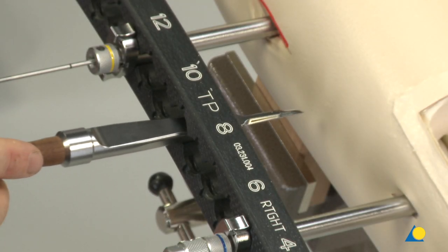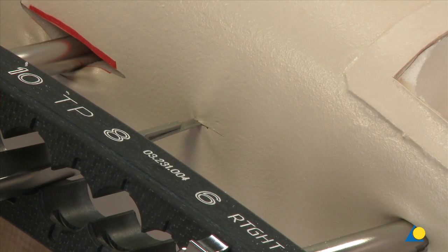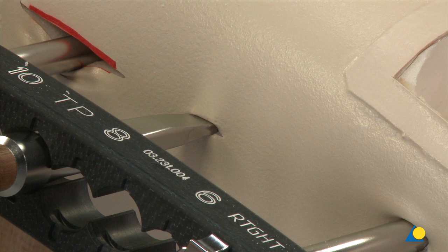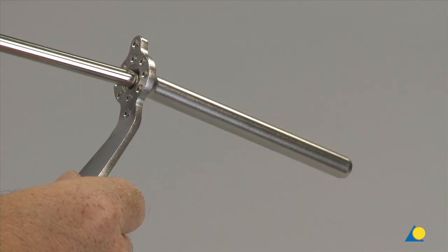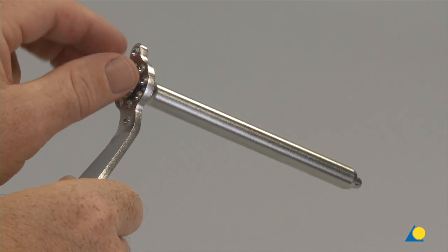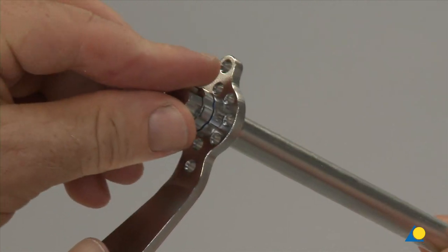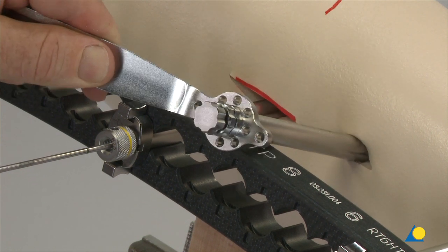Choose a hole in the aiming arm and make an incision through it. Insert the drill guide into the protection sleeve and screw into place. Insert the trocar into the drill guide. Insert the assembly through the incision and into the plate hole.